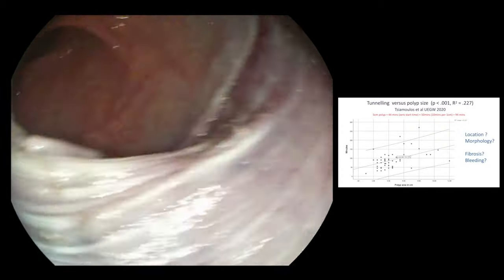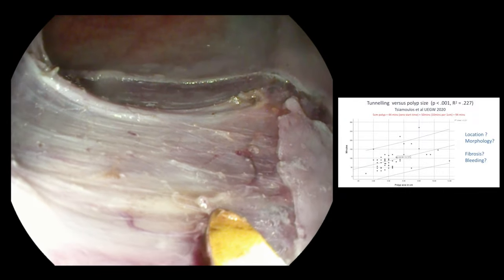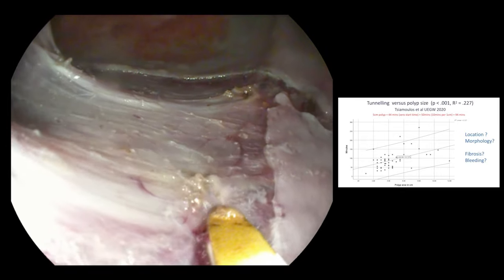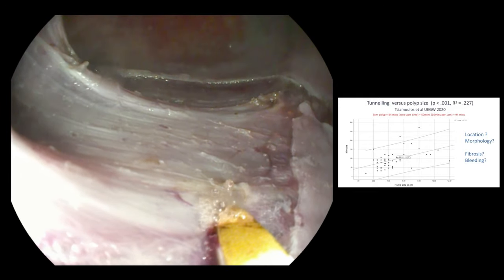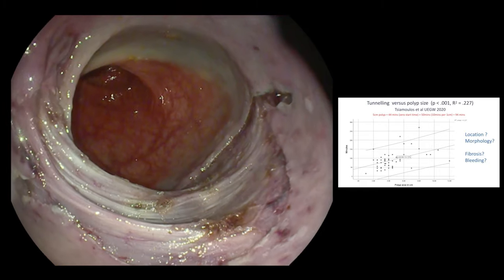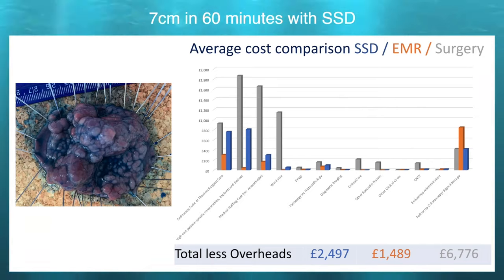But of course, we have to look at the location, morphology, and fibrosis elements. But you can see the muscle bed following the resection is quite clean. There's no carbonization. The muscle bundles are preserved without any damage because of the whole design of the device. This is a resection that took us about 55 minutes. The patient went home the same day, and there were no complications.